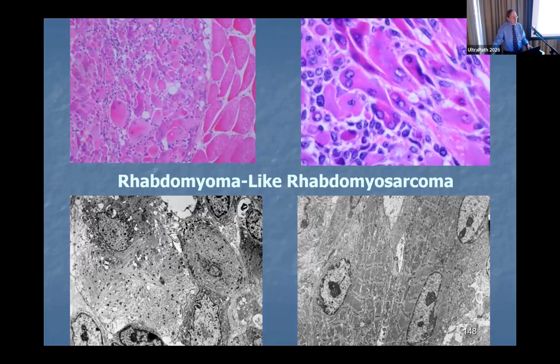This was sent to us as a rhabdomyoma, but one of the things you find with rhabdomyomas, and typically they have fairly well-differentiated rhabdomyoblasts, such as you see in the middle of the upper left-hand corner there. The ones that are still kind of ovoid to round, larger skeletal muscle cells. In the right-hand area, the thing that you need to pay attention to is not necessarily the larger cells, but the smaller cells. The smaller cells actually look like they fit into rhabdomyosarcoma.